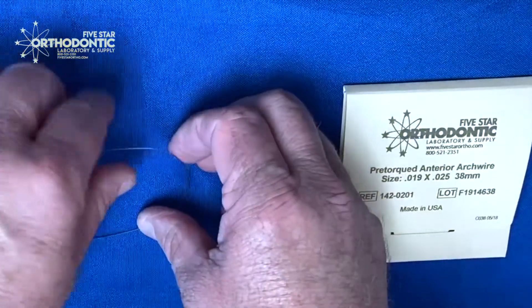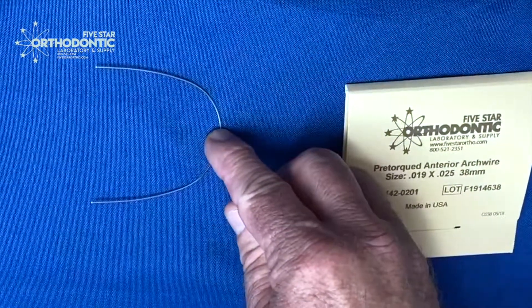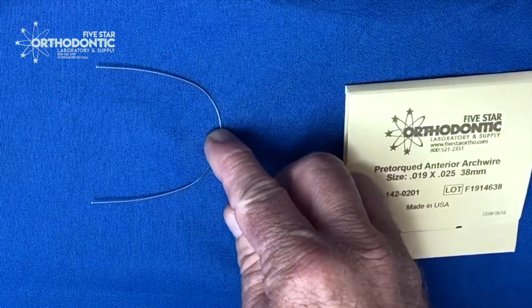This same wire, if we flip it over and still use it on the maxilla, we push it and nothing happens — this is going to tilt the teeth lingually.